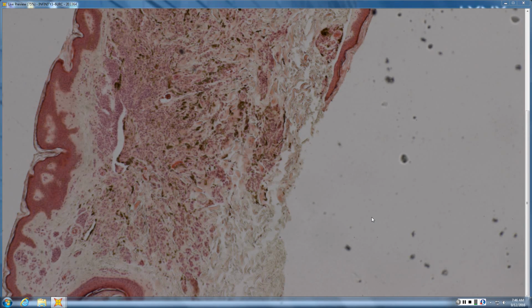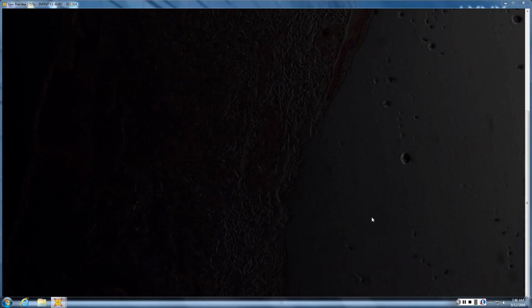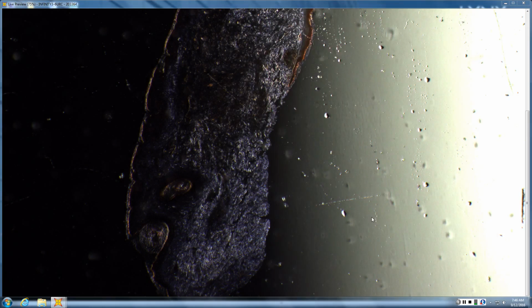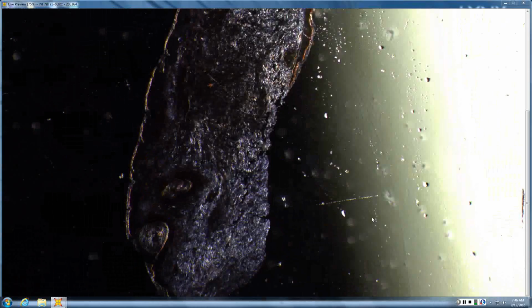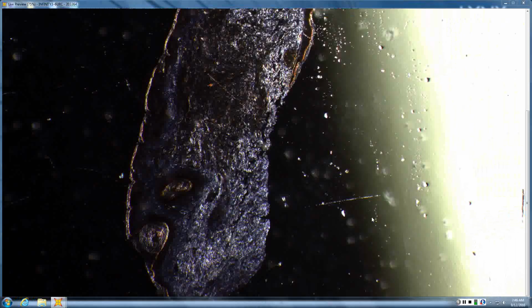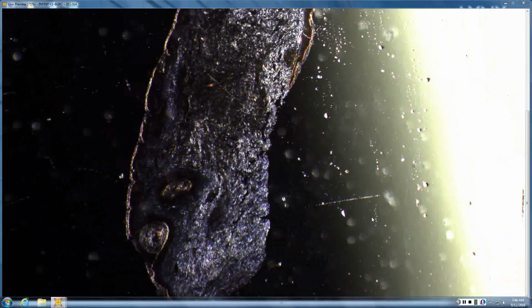Can you do that for us? Sure. What you'd expect is you're going to have a funny mixed pattern here, right? Because it's combined, and you're going to have some collagen that's refractile there. It shows up better at 2x. So if you look there, most of the darkness you're seeing is just the cellular population, but you still have some trapped collagen in there, maybe some dark collagen that goes with the blue nevus, but kind of a mix, which is what you'd expect.